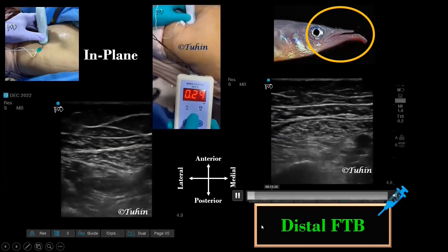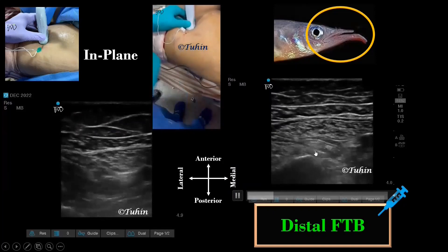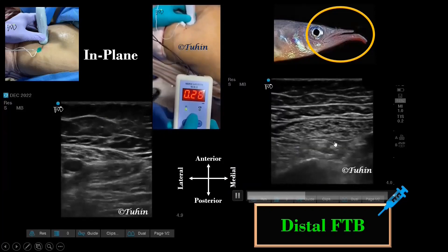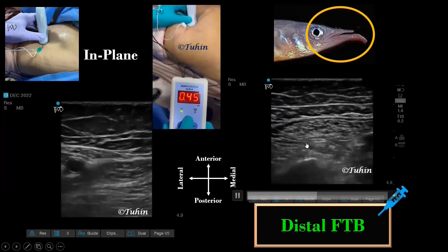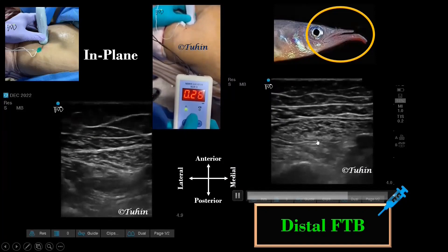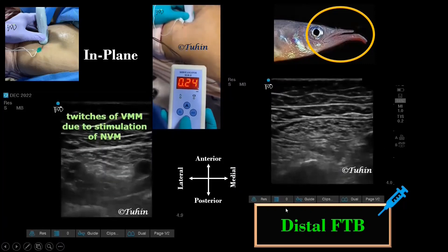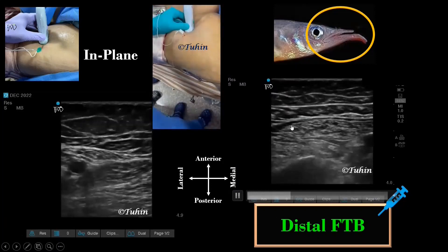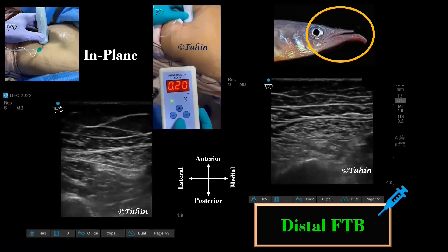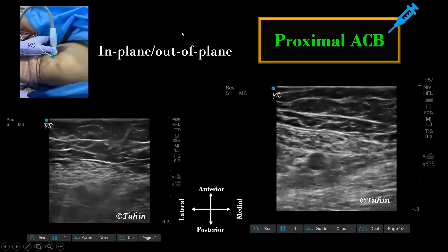The first local anesthetic is deposited around the nerve to vastus medialis, and then the needle is withdrawn and redirected towards the saphenous nerve. In another video on distal femoral triangle block, we can see one, two, or three hyperechoic oval structures next to the femoral artery — sometimes the medial retinocular nerve lies next to the nerve to vastus medialis. The nerve to vastus medialis is targeted first, then the needle is withdrawn and redirected towards the femoral artery to block the saphenous nerve. Five to ten mls of local anesthetic is deposited around each nerve; in adult patients 10 to 20 mls is usually adequate. Please avoid injecting higher volumes at this region as it might spread proximally and block the femoral nerve and its branches, leading to quadriceps weakness.